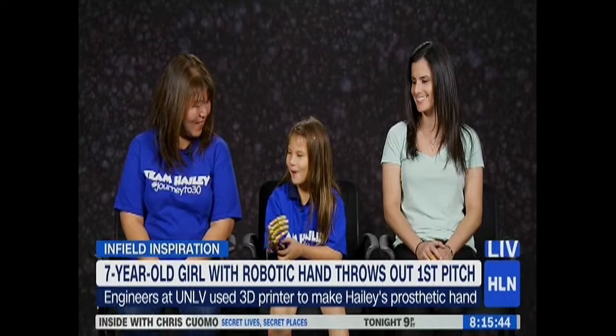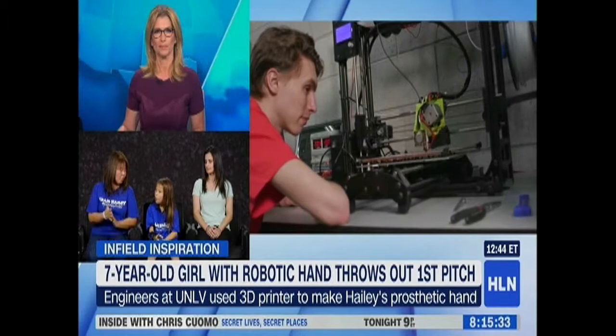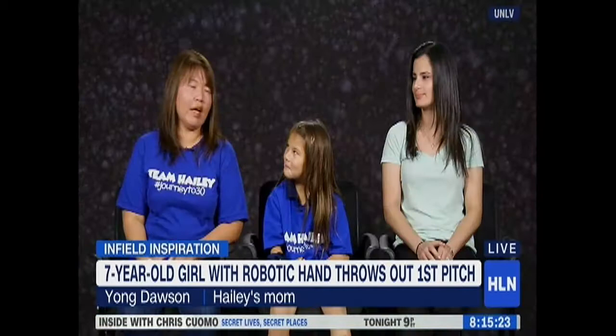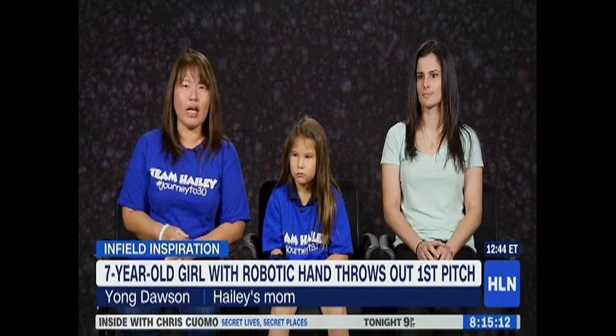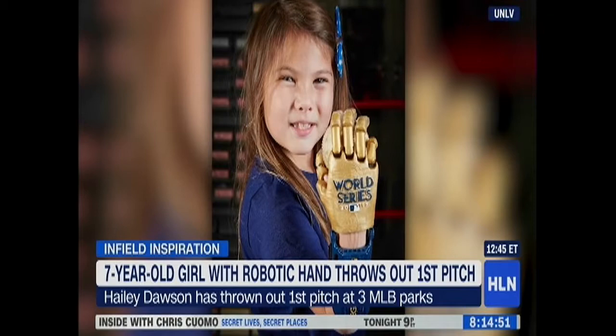Does Haley wear her bionic hand all the time? No — it gets kind of warm on the inside sometimes, but she kind of wears it when she wants attention. It started off as something functional, but it slowly became a confidence builder for her. When she puts it on, she's surrounded by all her classmates and they love seeing it. On Halloween she was actually Wonder Woman — she had her hand and Wonder Woman shoes. The first thing that happens is everybody wants to see it, touch it, and everyone wants to be around Haley, so she loves when that happens.